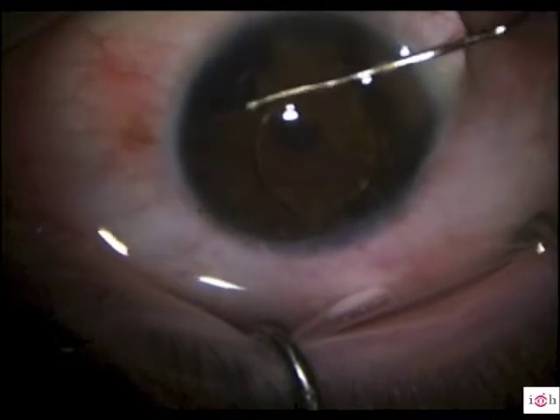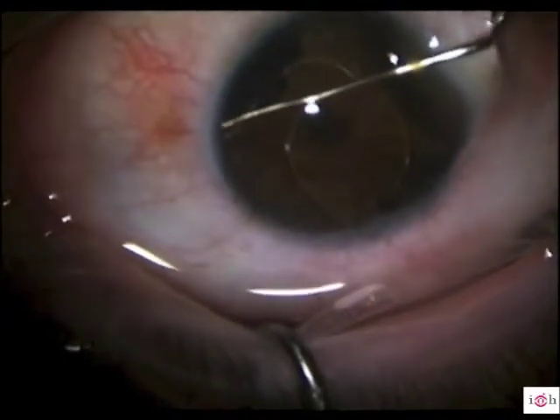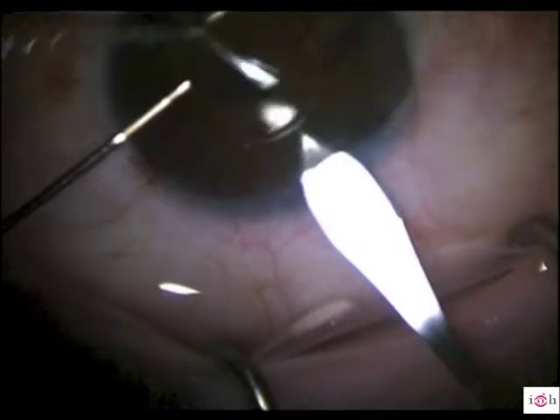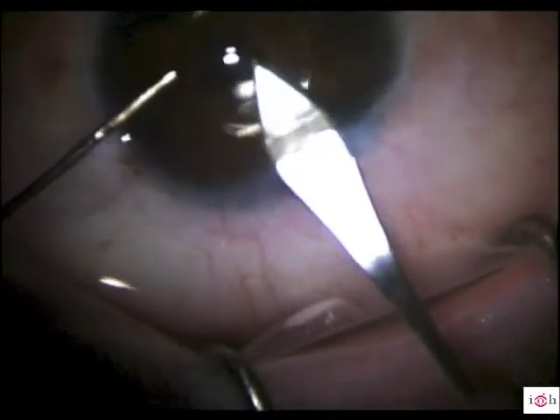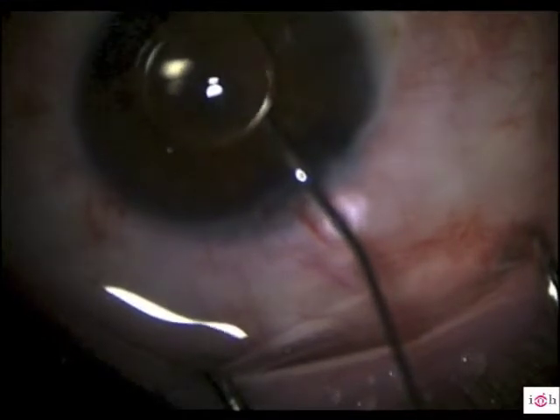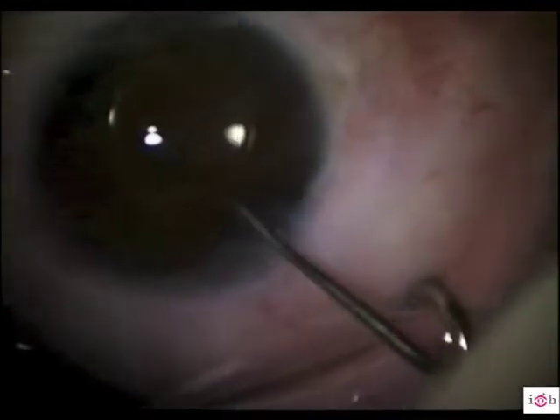With a Synechialysis lens manipulating hook and rotating maneuvers, we managed to release the inferior haptic of the lens. Then we performed a 2.5 mm clear cornea superior incision to facilitate the manipulation maneuvers to release the superior haptic. We used cohesive viscoelastic and 2 manipulating hooks.